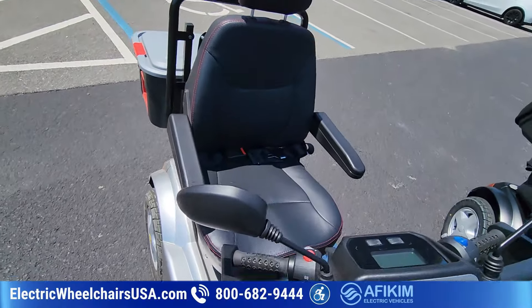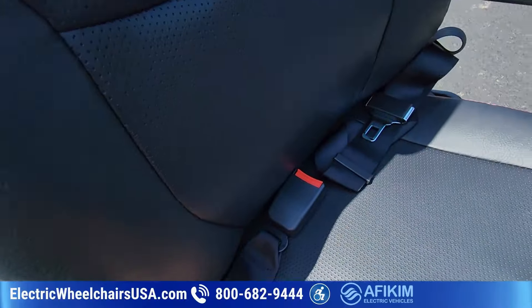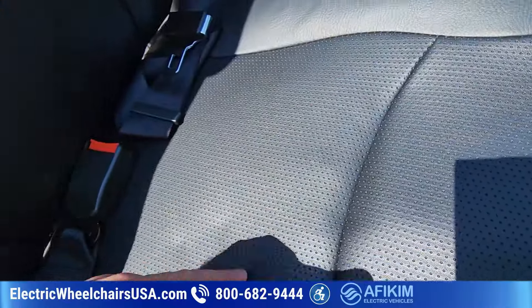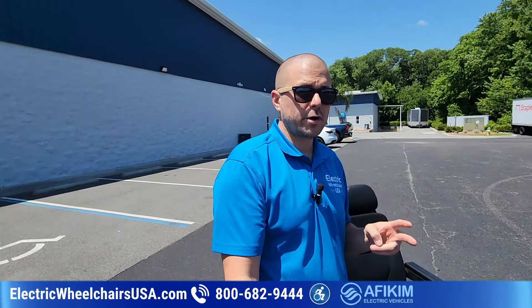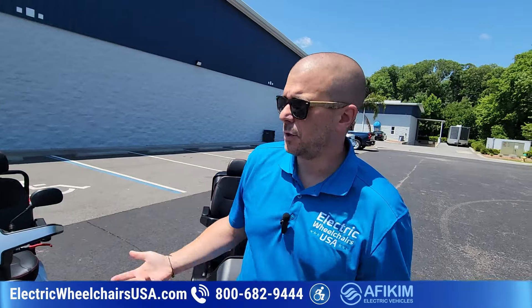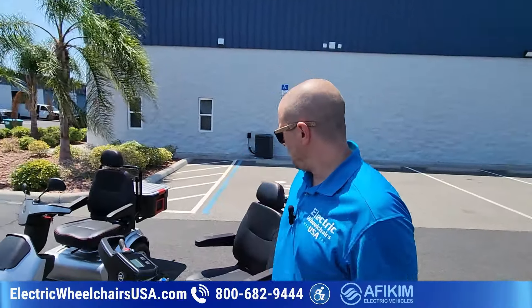The seats come standard as a 20-inch captain seat — super comfortable. You can see the stitching; it's a breathable material, really like a luxury car seat with nice red stitching. The seats also swivel and slide forward or backwards. You can get a 22-inch wide or a 24-inch wide captain seat, or you can get a dual captain seat — so if you want to ride with your spouse or significant other, you can do that. Those are all upgrades.